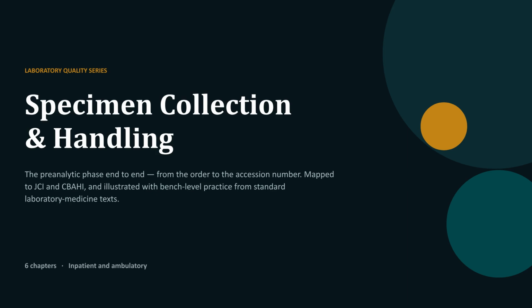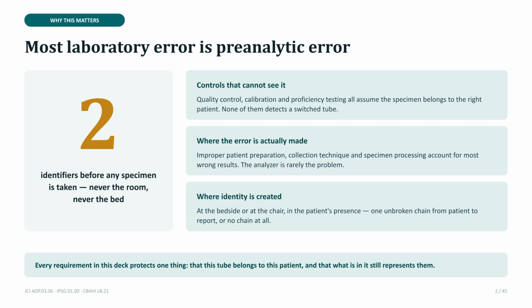Welcome to this video on specimen collection and handling. This is a look at the pre-analytic phase from start to finish. We will cover accreditation requirements and practical bench-level procedures. Most laboratory errors happen before the sample reaches an analyzer.